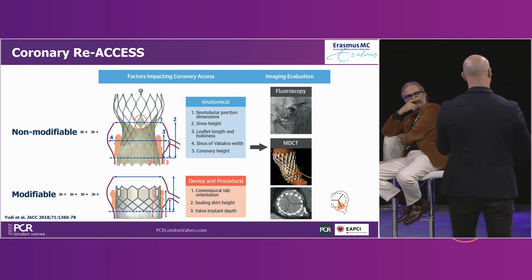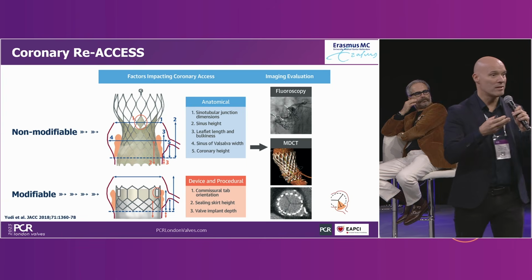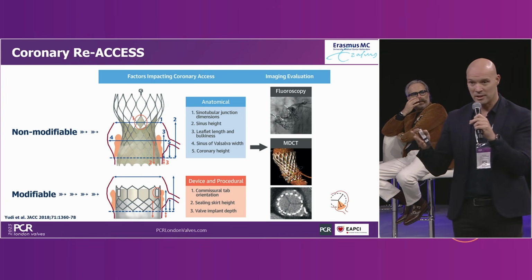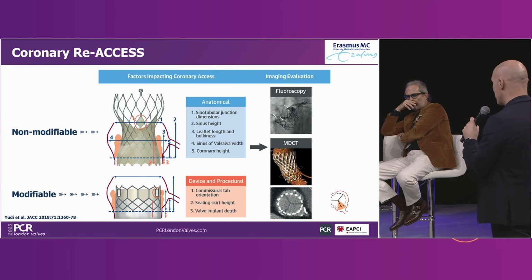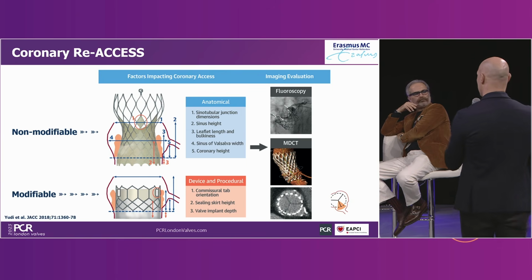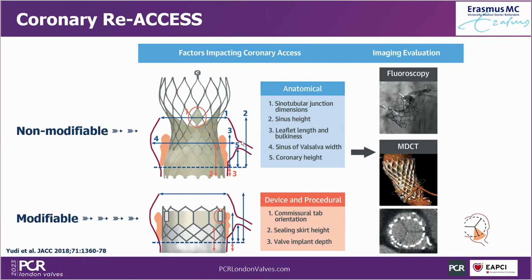I think we are all familiar with the latest generation valves. They all have a sealing fabric on the outside. This sealing fabric is meant to reduce the issue of paravalvular leaks, but at the same time, especially if there is not enough space, the sealing fabric will also affect your ability to re-enter the coronaries.